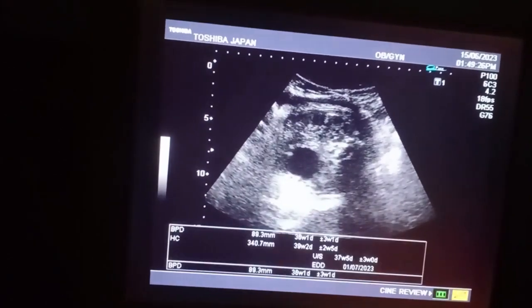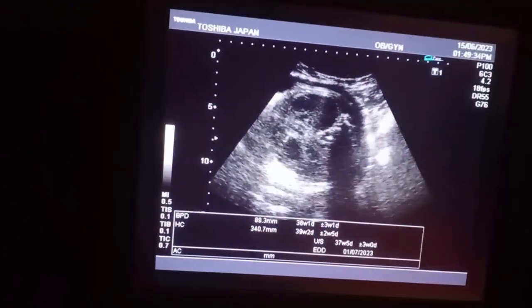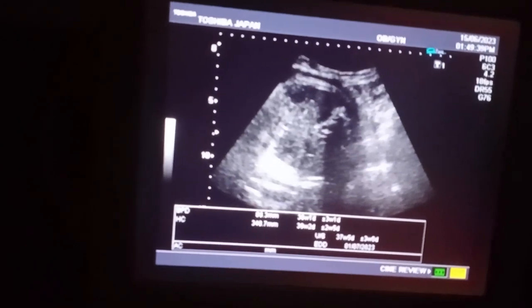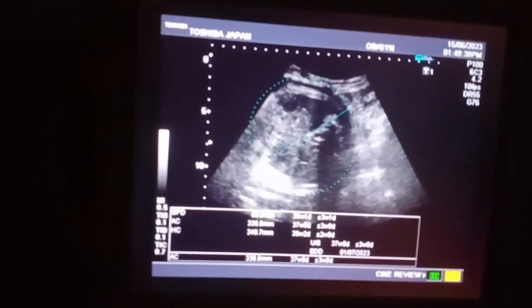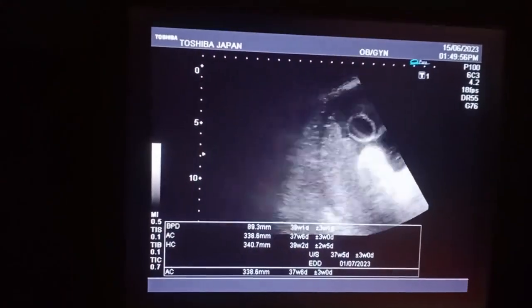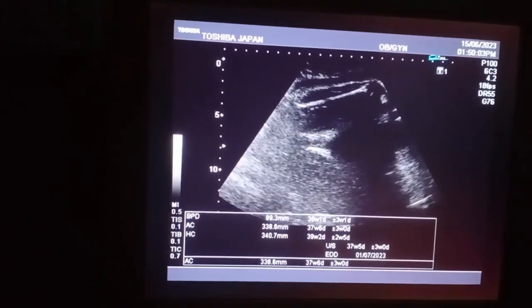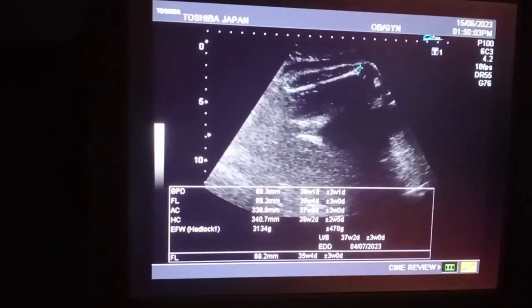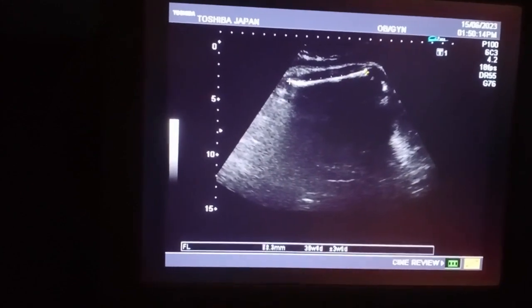I would like to calculate the abdominal circumference at the level of the gastric bubble. Then I would like to calculate the femur length, and in between the femur length measurement we would like to see the sex or gender of the baby. The femur length is also at 37 or 38 plus weeks.